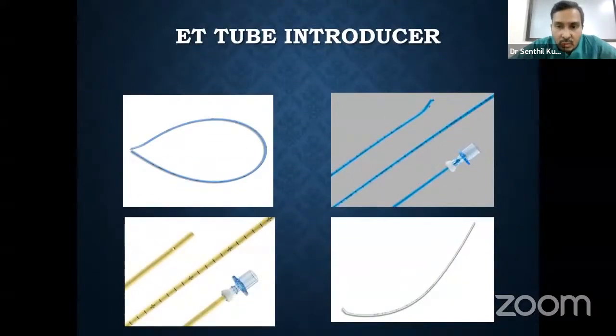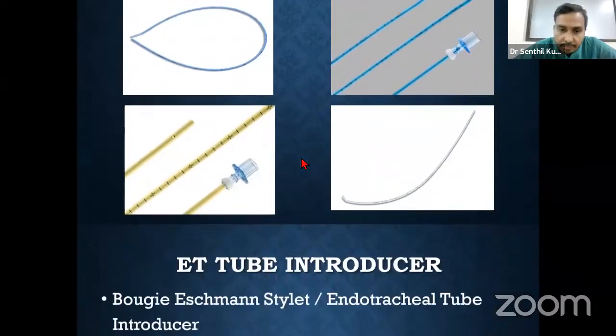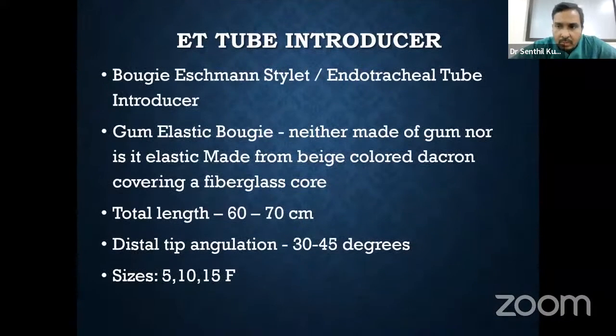Coming to the other adjuvant devices for difficult airway management, this is the endotracheal tube introducer, commonly called a bougie. So these are all the commercially available types of bougie: gum elastic bougie, Frova, Cook Medical Airways, and the other intubating introducers. In the pre-video laryngoscopic era, it is one of the common devices which we always had in our hands. So it is one of the very important devices which is going to help us in management of difficult airway.